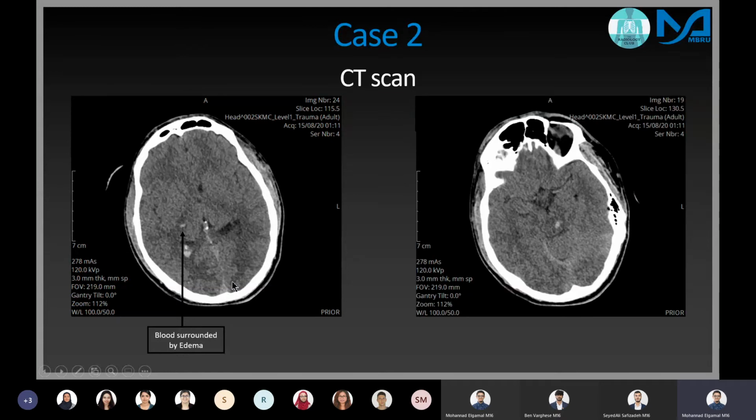If you look at the general structure of the skull, we don't see any fractures. Usually you just switch to a bone window to help determine if there are any minor fractures. There's no obvious hemorrhaging pushing against the brain. You'd have that, what was it called? Mass effect. You can see his sinuses filled with air.